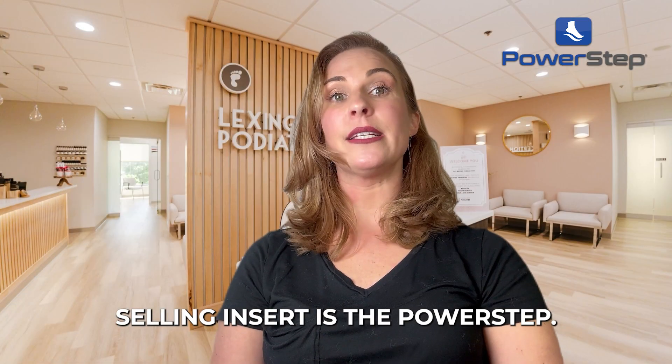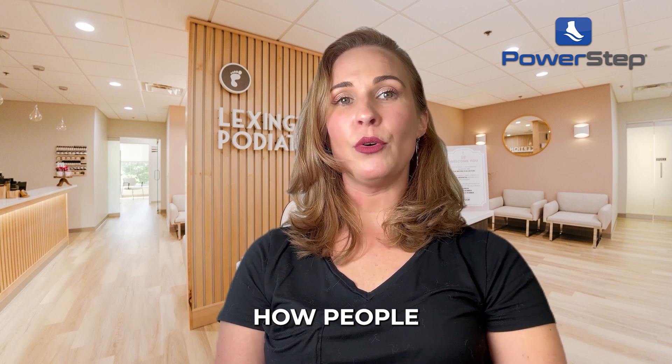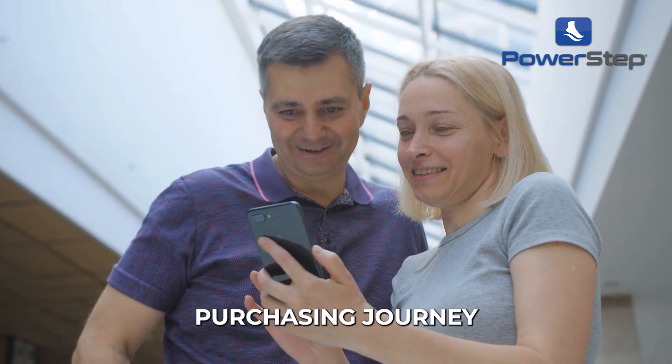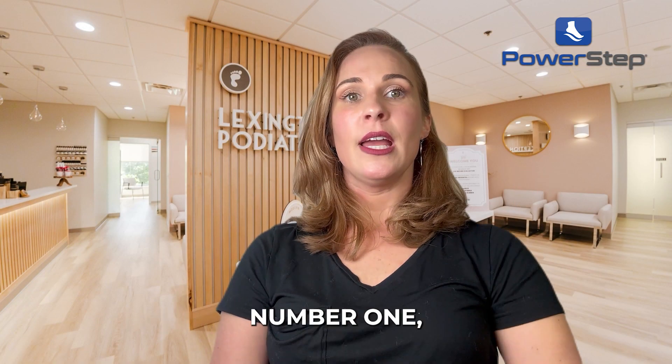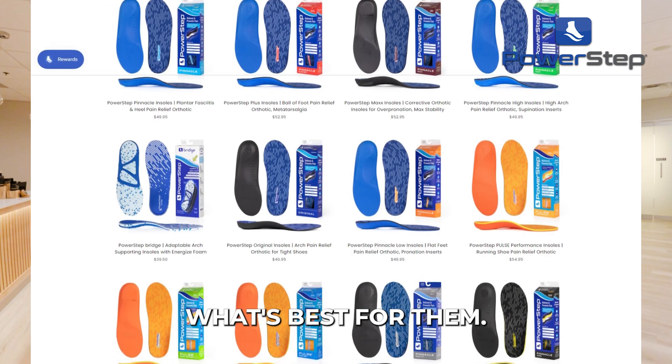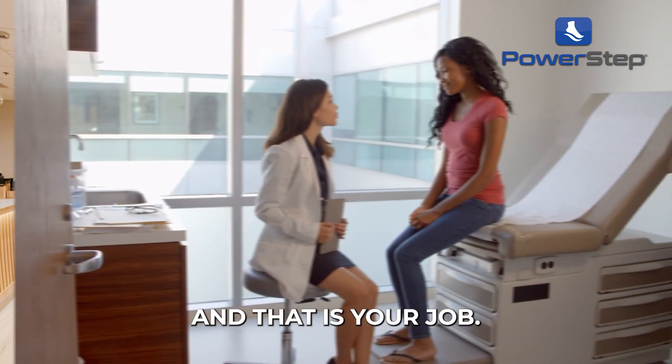My best-selling insert is the PowerStep. If you've ever researched the patient purchasing journey and what they're typically going to pay for, number one, you have to select what's best for them. They don't know. They're there because they need information and help, and that is your job.